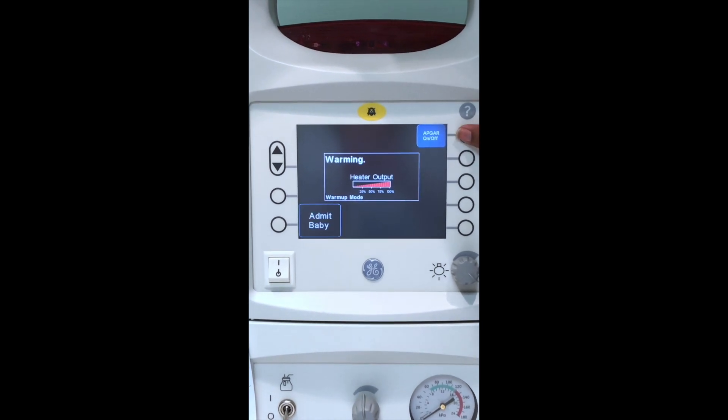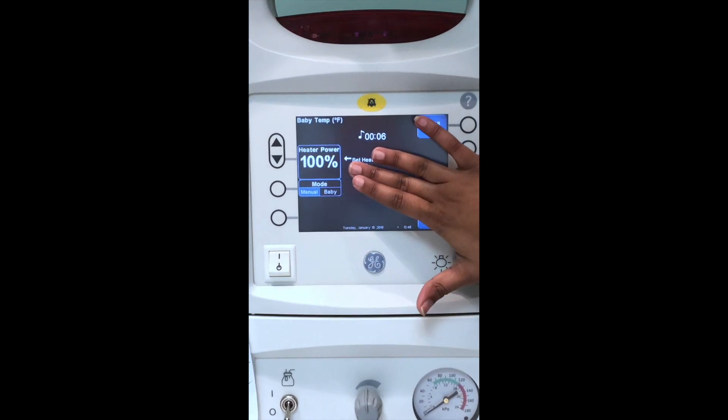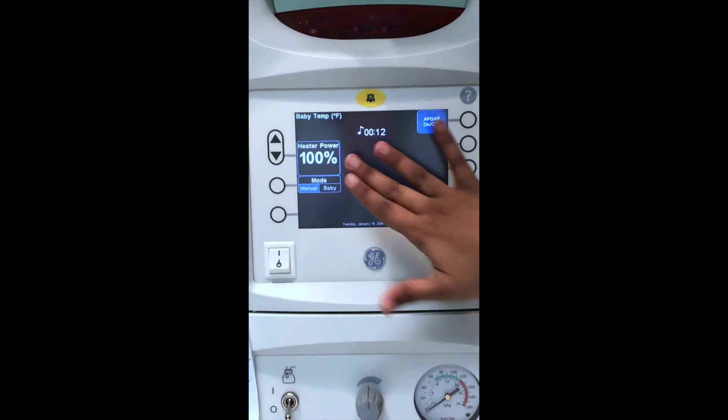So when the baby comes out, we'll press APGAR on or admit the baby, and it's counting your APGAR score at 1, 5, and 10 minutes — it'll beep. Your heat is at 100%; it's blinking because it wants you to acknowledge it, so you're going to press either one up or down. And now it's set.